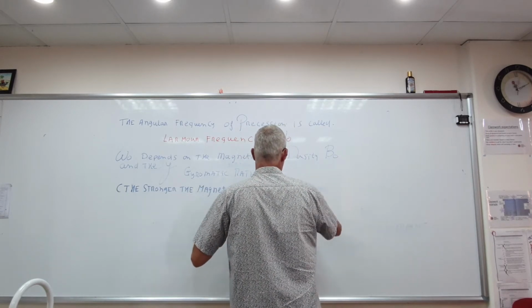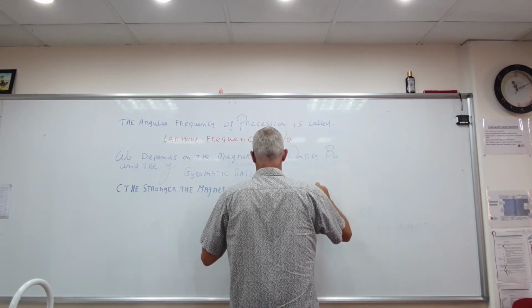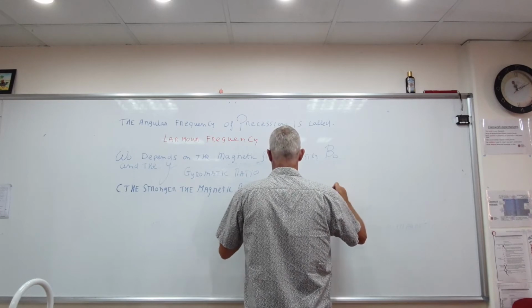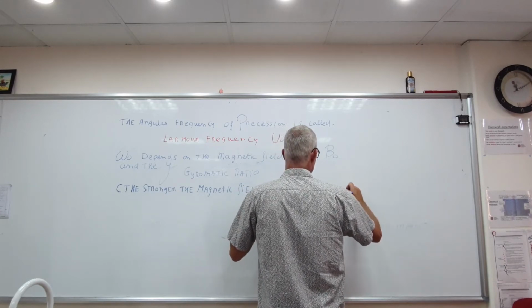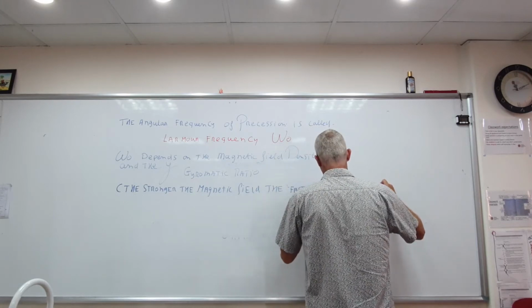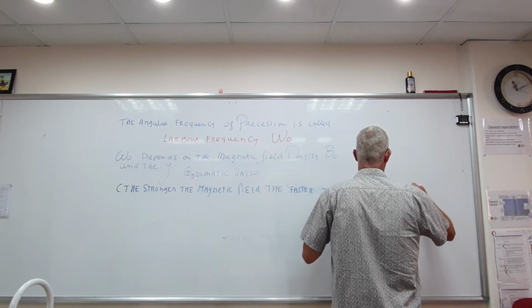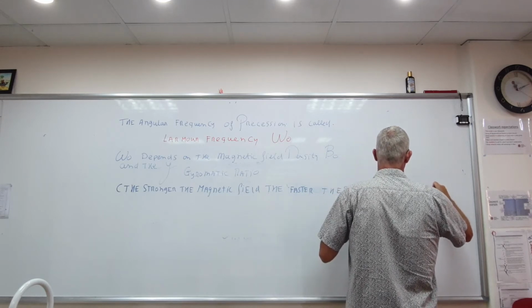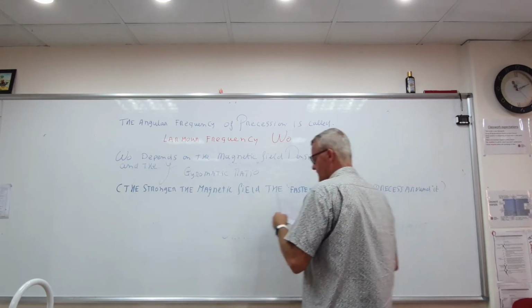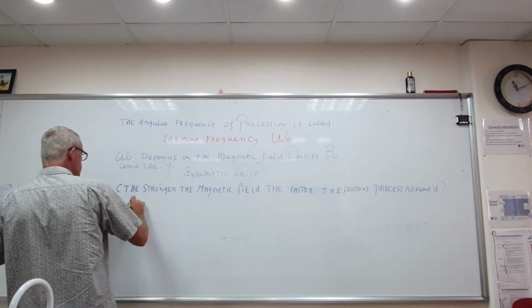I would say better, faster the protons, as we say, spin, but better say precess around it. Okay? Obviously, you know physics, formula.